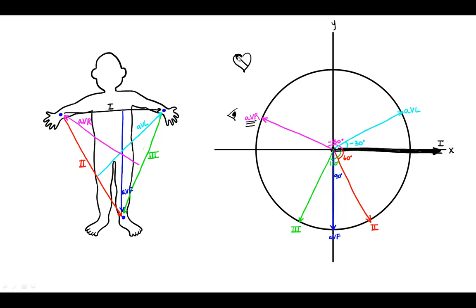And as we know, that's probably not a good thing if we want the heart to depolarize from here to here, which is normal physiologically. And so a pie chart like this can help a doctor to really figure out whether charges are moving in the right direction at the right time. So that is our summary of the limb leads.